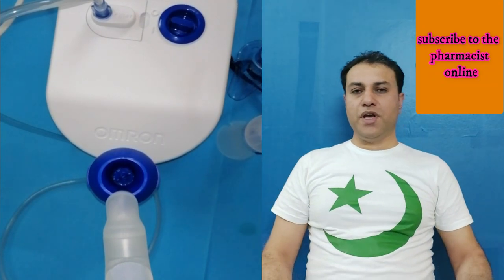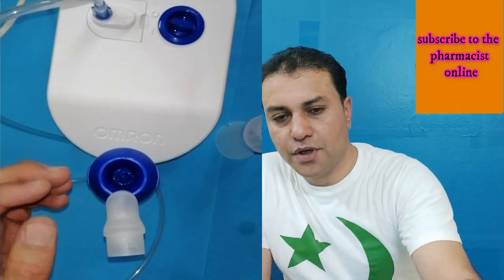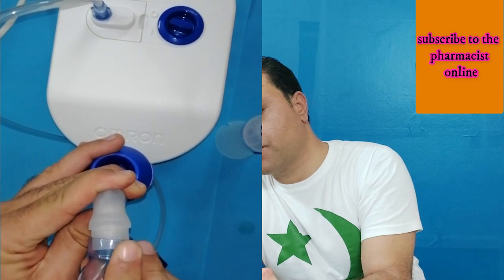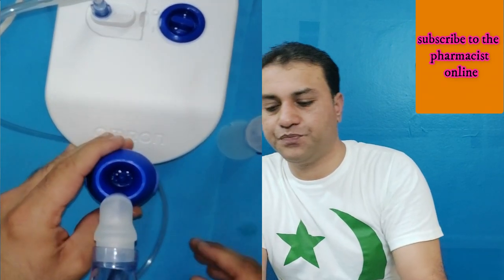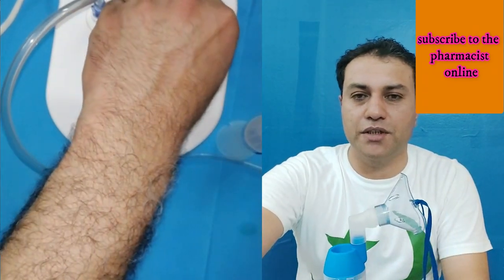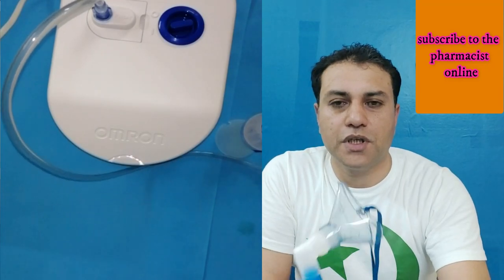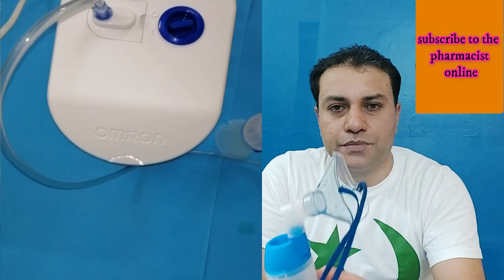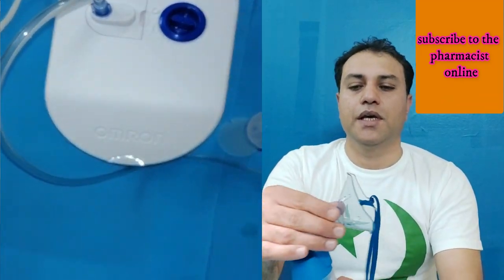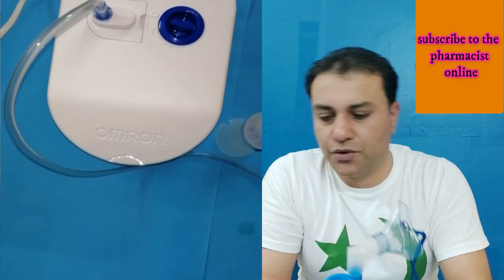In the same way you can use the pediatric mask. Just attach the pediatric mask here to the medication container. Take it around the baby's head and turn on your device. In the same way you can use this for children.